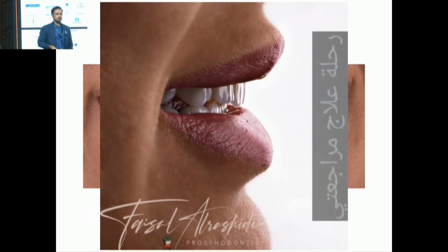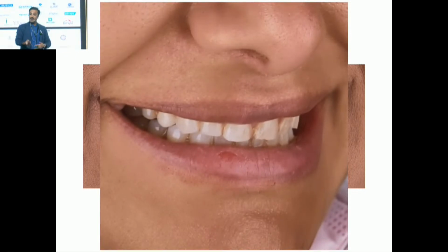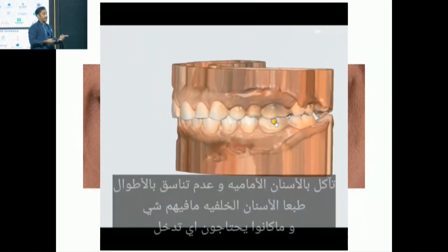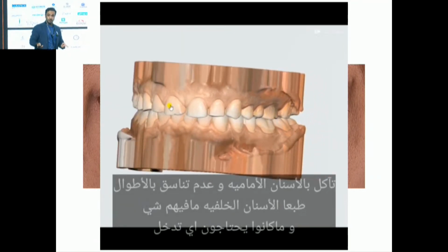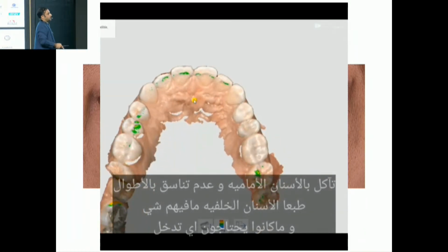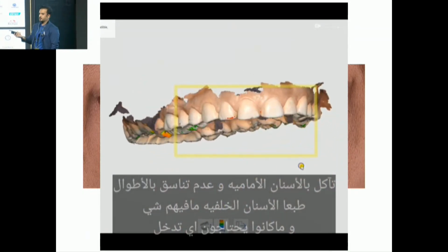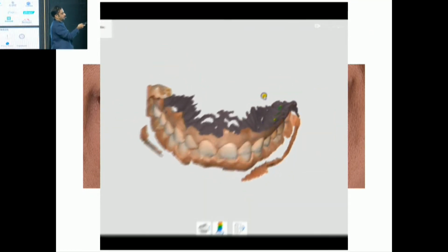I took a scan, and that's why I love digital dentistry. It's a tool for me, for my lab, for my patients, right? So I know that there is wear in the anterior area. I can take the scan. I can assess the posterior teeth through AI, through artificial intelligence, through my intraoral scanner. I can check the bite, and you can see the marks. You can see the bites, and you can see the anatomy of the posterior teeth. They're not worn down. So I told her, you know what? We'll just open the bite.